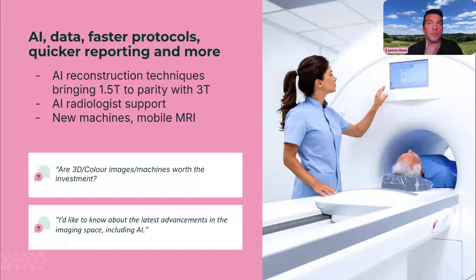People have been training algorithms. The classic barrier is that it's not easy, but relatively easy, to train an algorithm to be very good at one thing. So you might train an algorithm that's very good at looking for lung mets, but on that chest X-ray you're also looking for pneumothorax, and infection, and any number of other things going on at the same time. So you end up having to run 3, 4, 5, a dozen different algorithms, each trained to look very specifically at one pathology type.